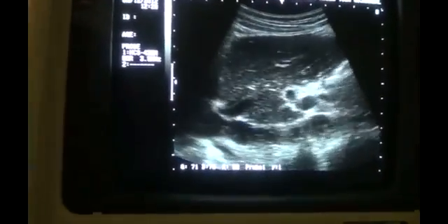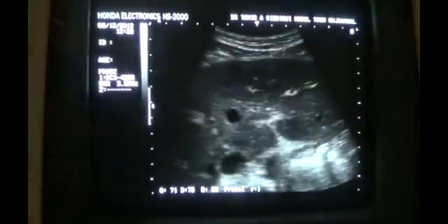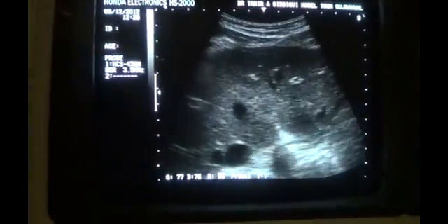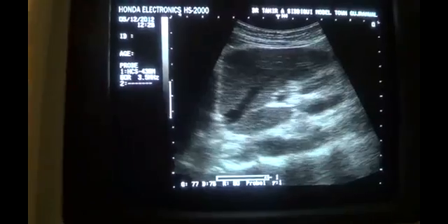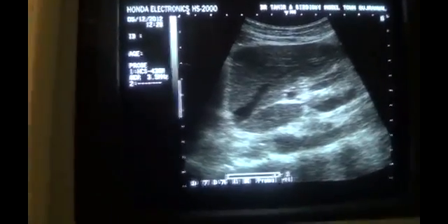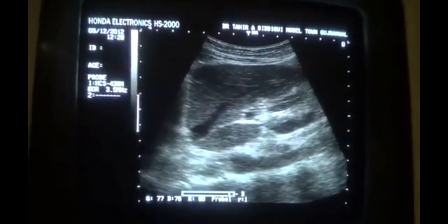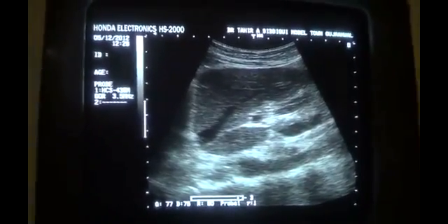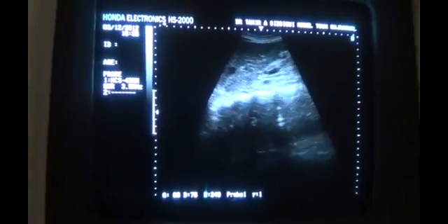In this case, it appears a bit prominent because it has its own separate blood supply compared to the rest of the liver segments, and that's why it retains its echogenicity even when the liver is involved by an inflammatory or fibrotic process. Thank you. This is segment 6 regarding the liver span.